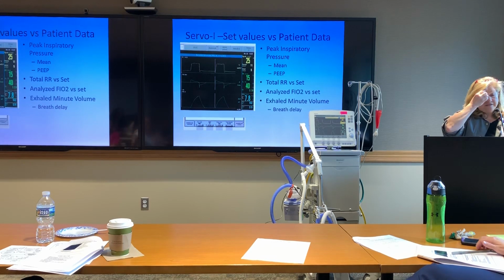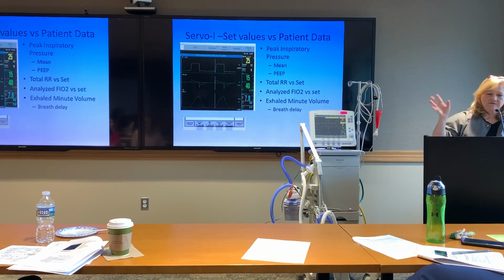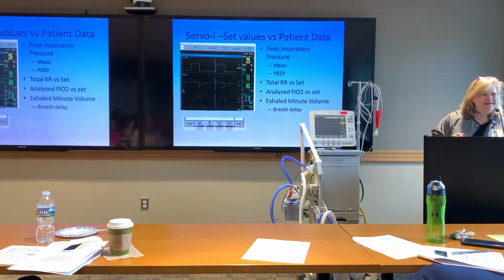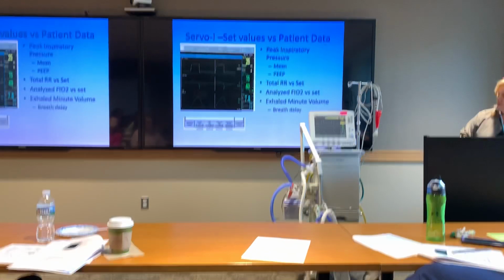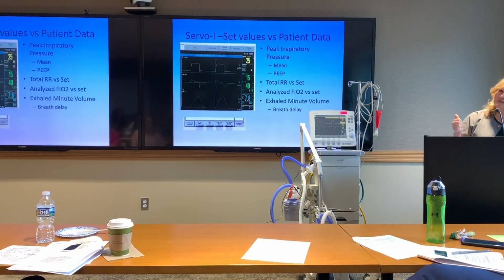But if their PF ratio is less than 300, then we will switch them down to 6, because 6 is really the safer tidal volume range, which is a big change for a lot of people, but not you guys, because you haven't been practicing long enough to know. Just trust me, it's a big change for some of us. Anyway, it's safer for the patient. So 8 was the new 12, right? And now 6 is the new 8. Everything is changing now.